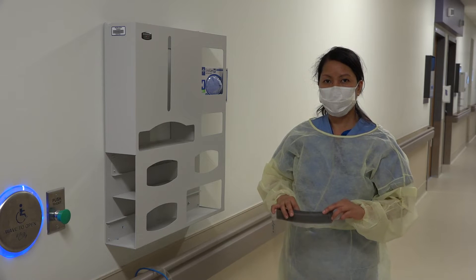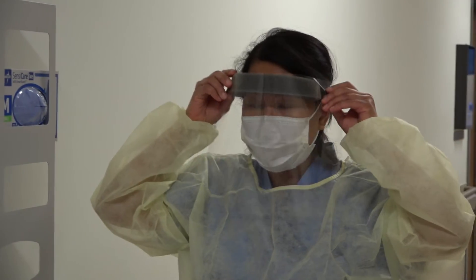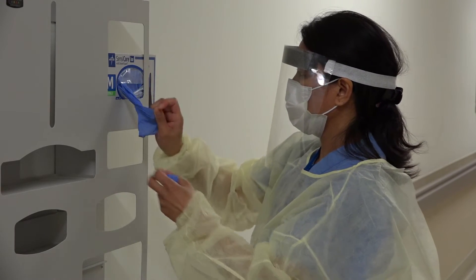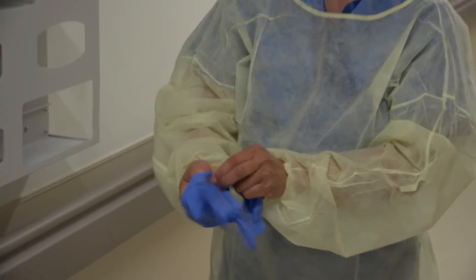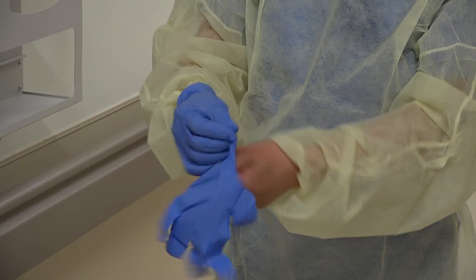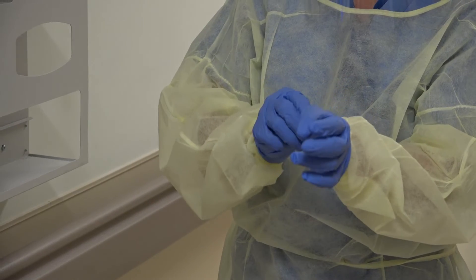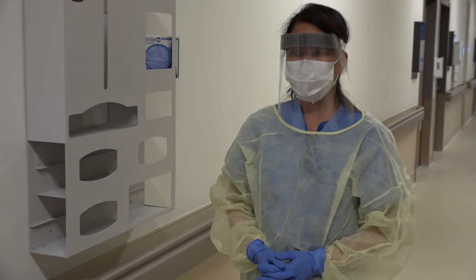The next step is to place your daily visor over the mask. The last step is to place on your gloves. Note that she is ensuring the gloves come up over the cuff of the gown. She is now ready to enter the patient's room.